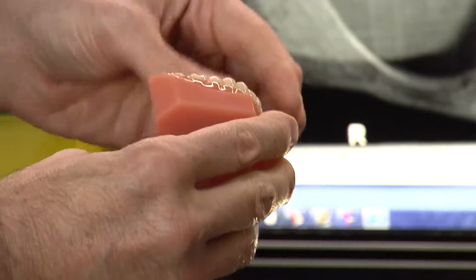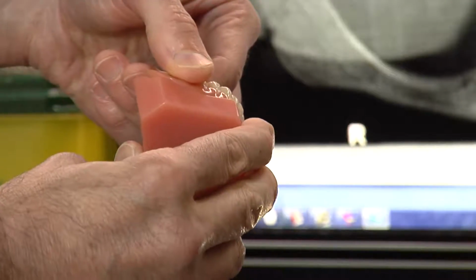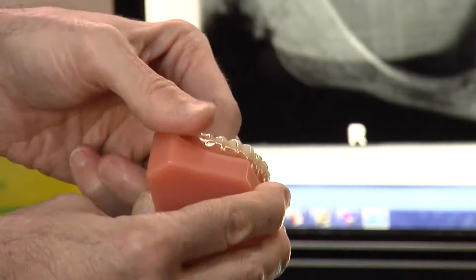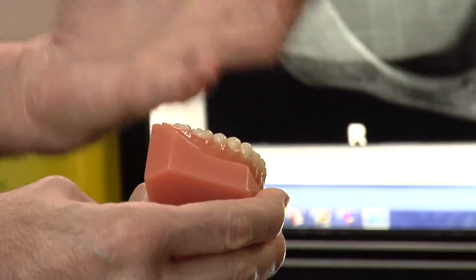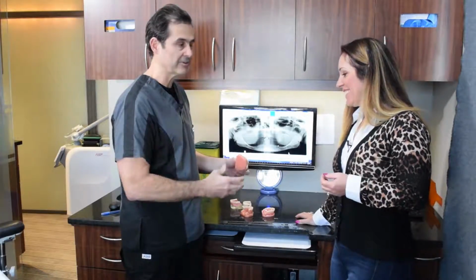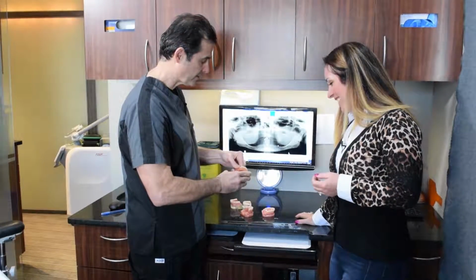And the other thing is that this is not a rigid connection. You can see here that this still moves. And it has to, because if we tried to rigidly connect to 2 implants, this lever arm here would overload those implants, and then you would lose the implants. So it wouldn't be strong enough. This is just used to help hold the denture in when you sneeze, so it doesn't fly out on you. At your grandkids. That's right. So that's what the clip-on denture does.